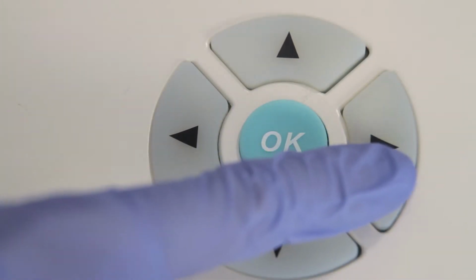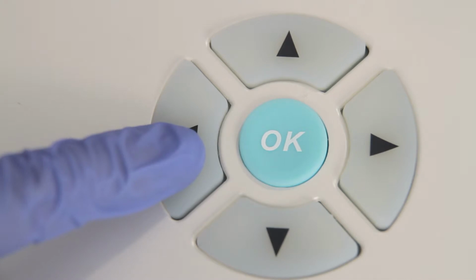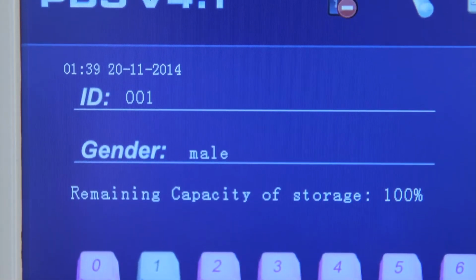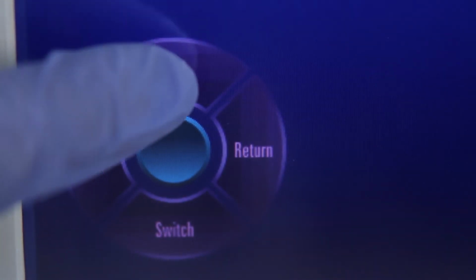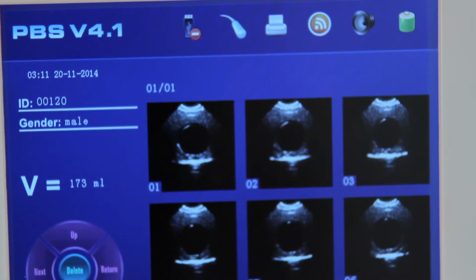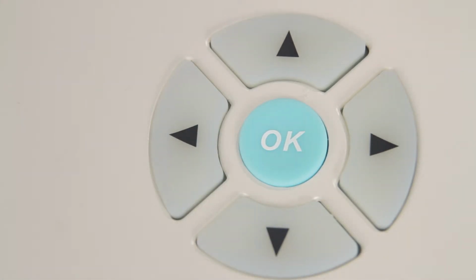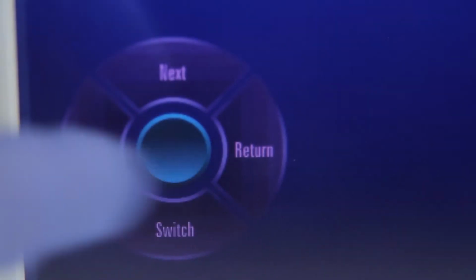Press the right directional key or touch the return functional key to return to the ready screen. Press the left directional key or touch the Save Edit functional key to enter the Save Edit screen. Press the up directional key or touch the next functional key to toggle between the scanned images. Press the down directional key or touch the switch functional key to switch between grayscale and two color images.